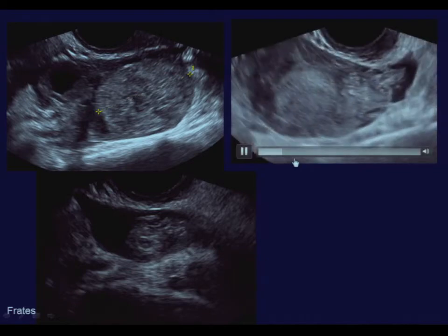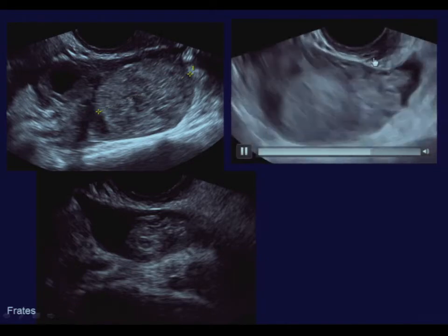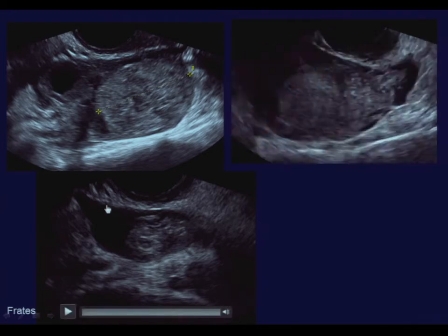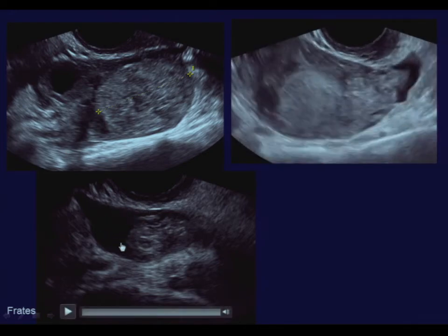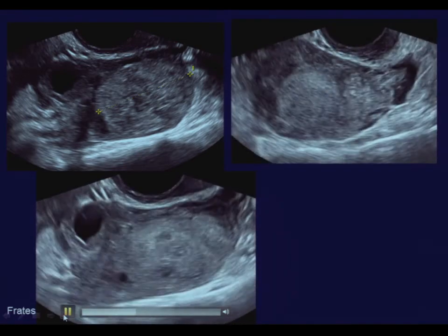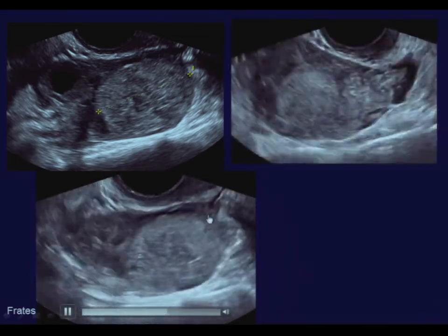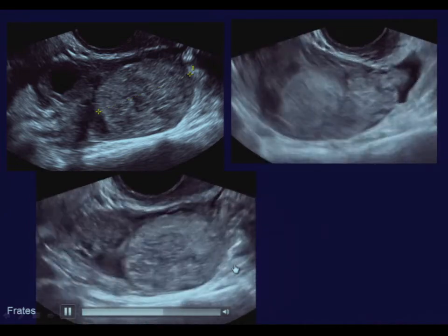But remember, look carefully at it and see if you can get it to move away from the ovary, or see if you can find a gestational sac within the center of it. Also note the adjacent complex free fluid, which is an important identifying factor in a patient with ectopic pregnancy. So when you do this, if you look at this clip carefully, you can watch the clip play and at the very end see if you notice anything.